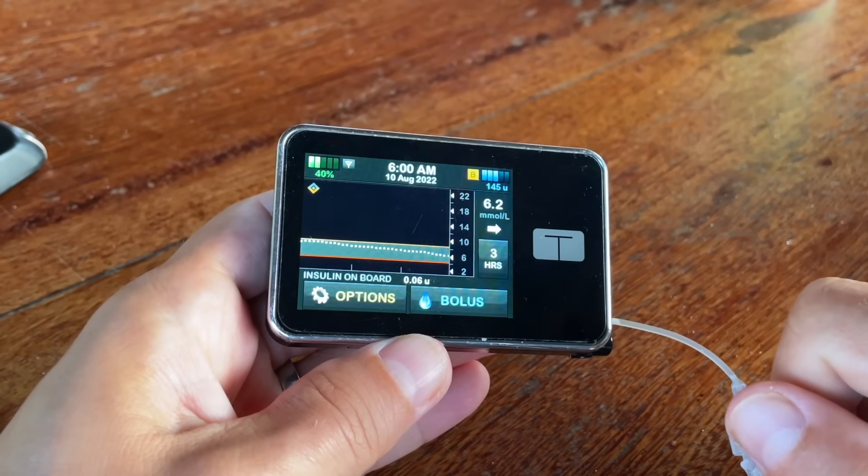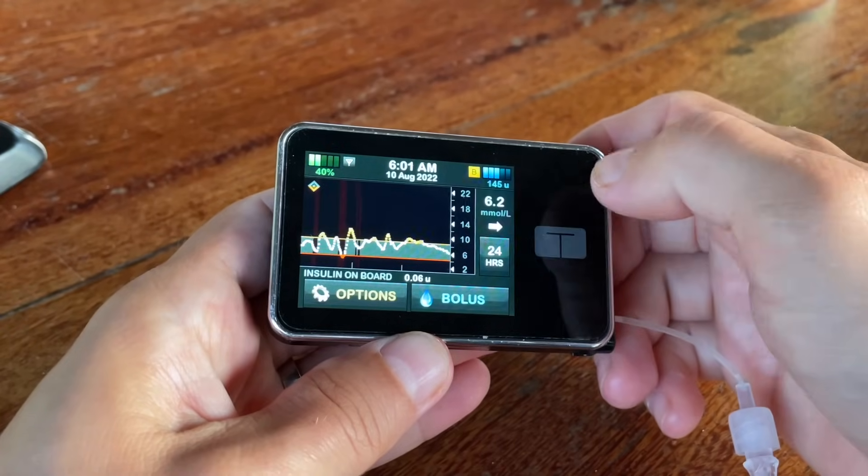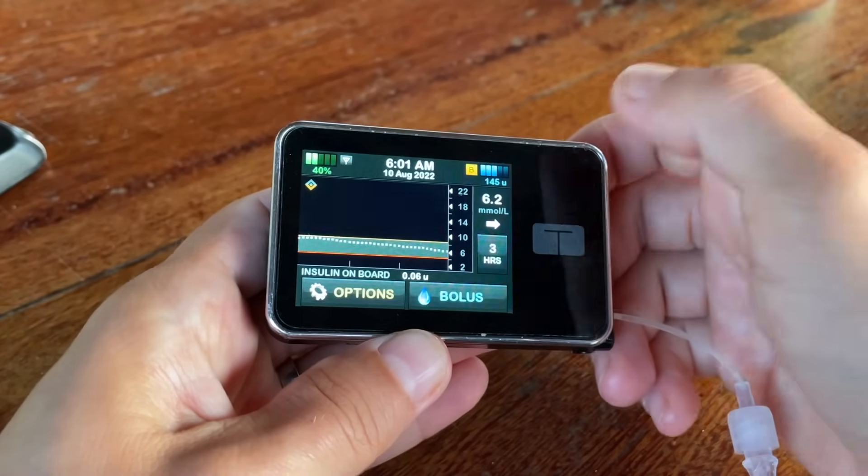When you're connected to a CGM you'll also see your blood sugar value and trend, as well as a graph for the last three hours which you can easily zoom in and out on. There are many more exciting things you can do when connected to a CGM, which I'll talk about later in the video.